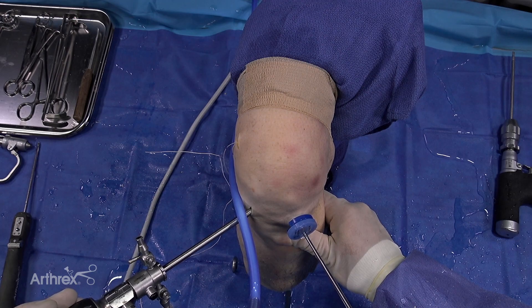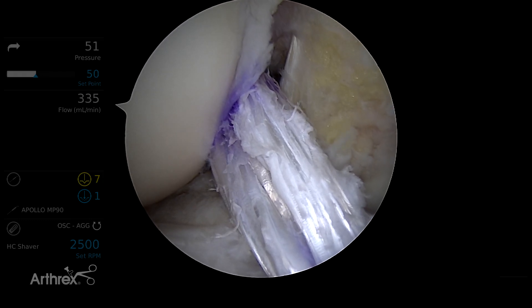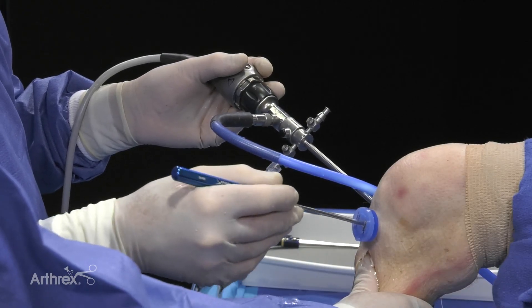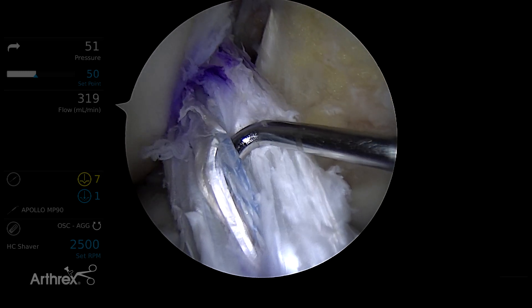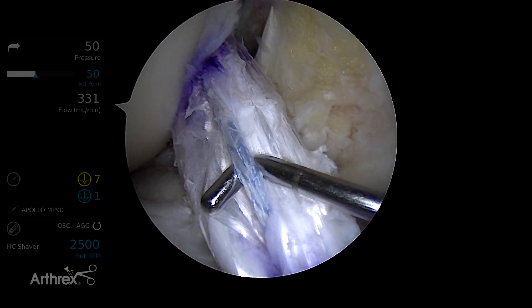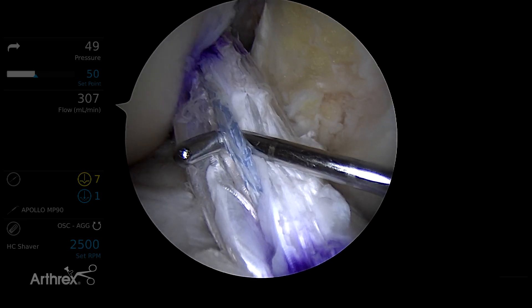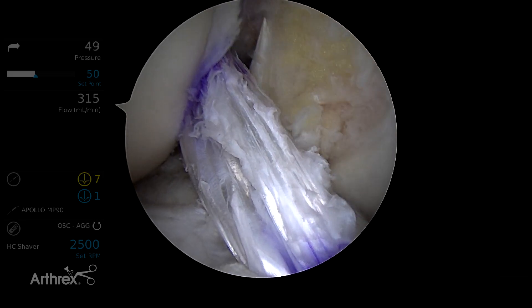For the purposes of this demonstration, I'm going to dig into the graft a bit to find the tapes, because I want to show you that there is going to be laxity of the tapes in flexion. The normal ACL goes through a loosening pattern from zero to 90 degrees of three millimeters. The tape was fixed in full extension where it would be the tightest, but it's going to be lax in flexion. Opening up this graft a little bit — here's one of the tapes. Look at the laxity of the tape — we're at 90 degrees of flexion. It's not too tight. The tape's an internal brace; we want the graft to see load. The tape is only going to kick in at a high load where there could be a stress to re-tear the graft. We want the graft to remodel and revascularize at the lower loads. At 90 degrees of flexion the tape has laxity, but it's right within the graft, so it looks really nice at the end.